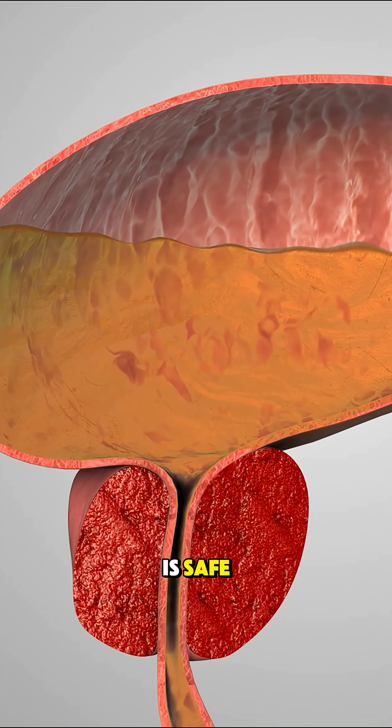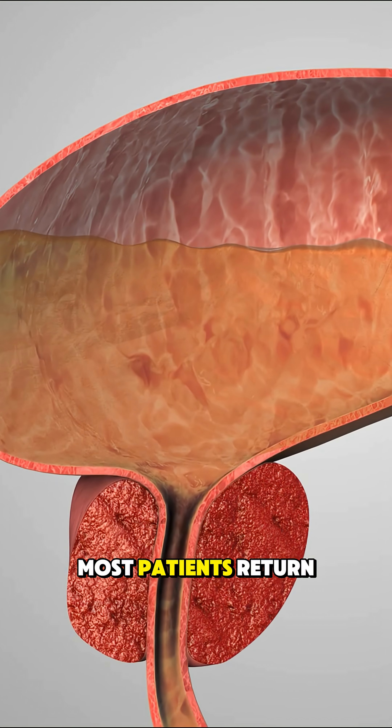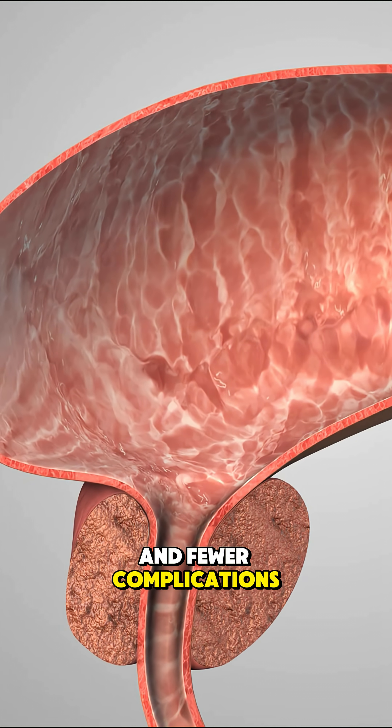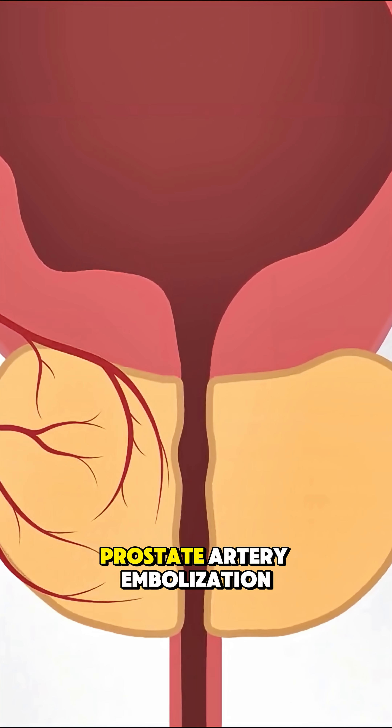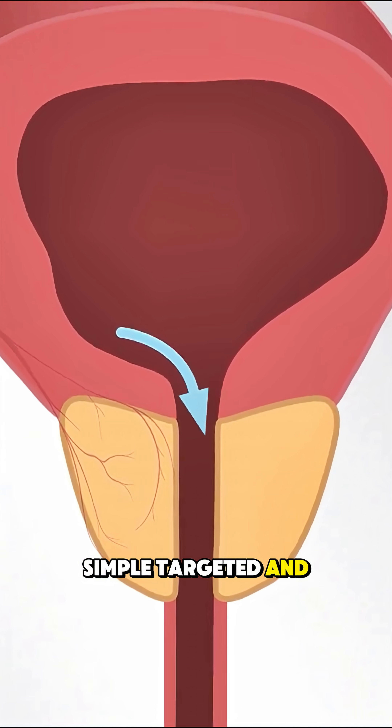PAE is safe, effective, and doesn't require traditional surgery or cuts. Most patients return home the same day with faster recovery and fewer complications. And that's how prostate artery embolization is done — simple, targeted, and life-improving.